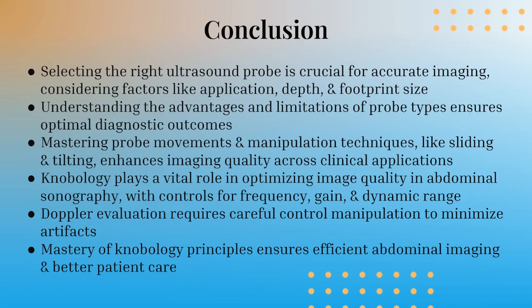Knobology plays a vital role in optimizing image quality in abdominal sonography, with controls for frequency, gain, and dynamic range. Doppler evaluation requires careful control manipulation to minimize artifacts. Mastery of knobology principles ensures efficient abdominal imaging and better patient care.